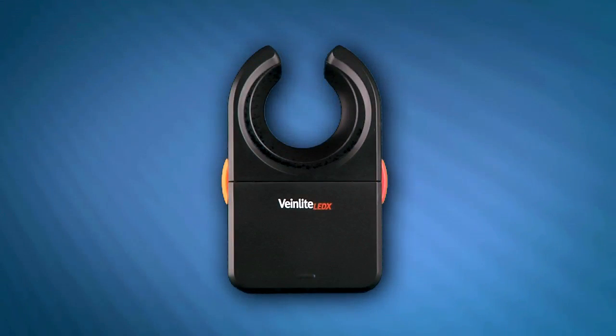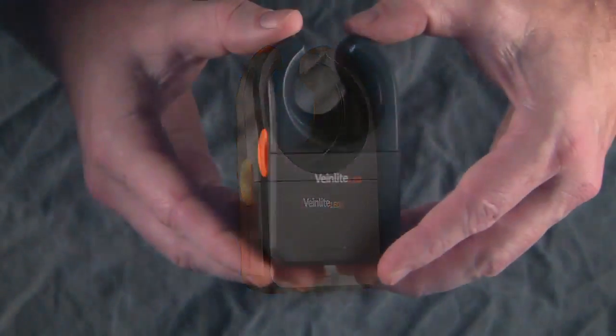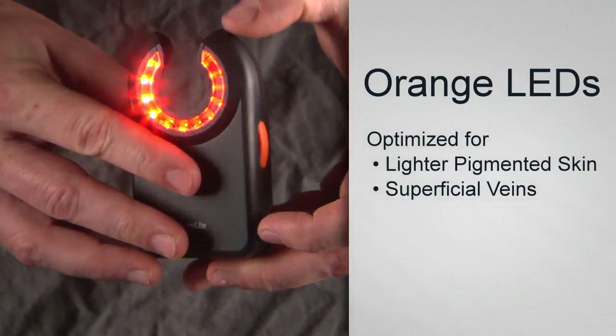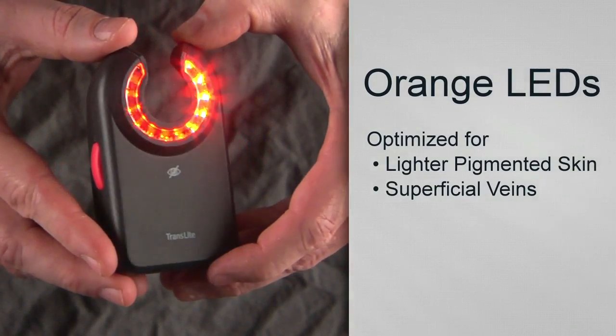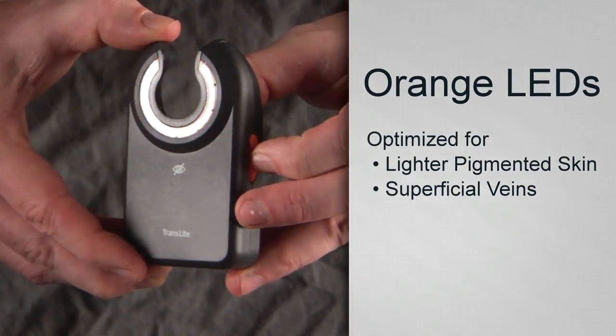VeinLight devices offer a simple one- or two-button operation. Two-button devices have a red and an orange button. When you press the orange button, orange LEDs will turn on that are optimized for illuminating lighter pigmented skin and superficial veins. To turn off, simply press the orange button again.